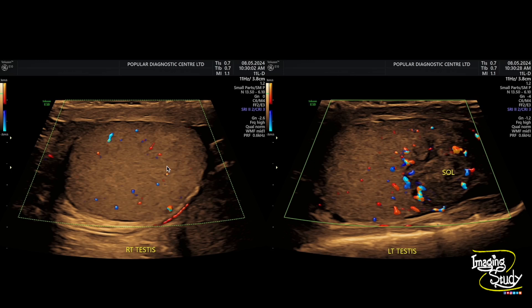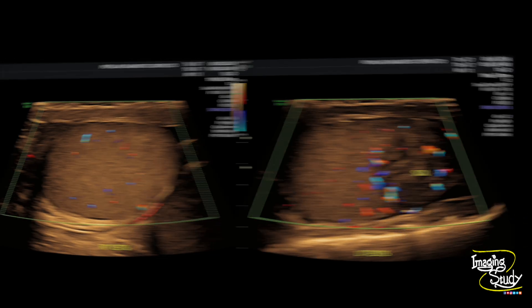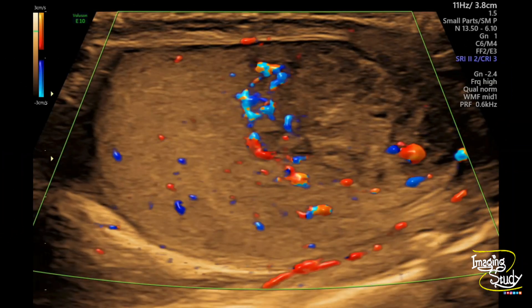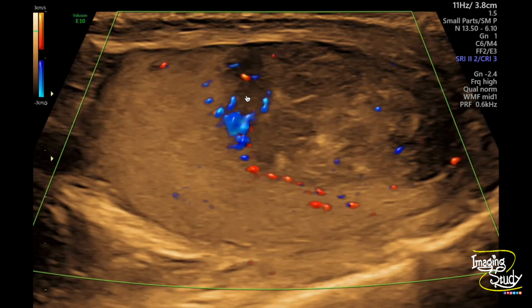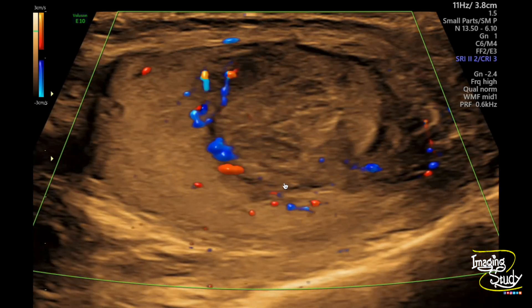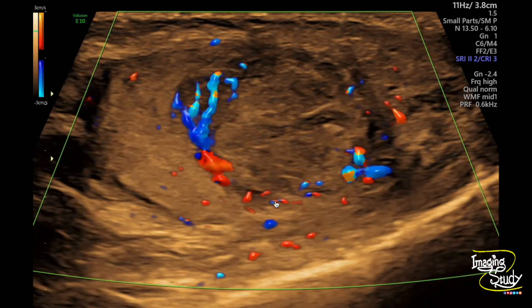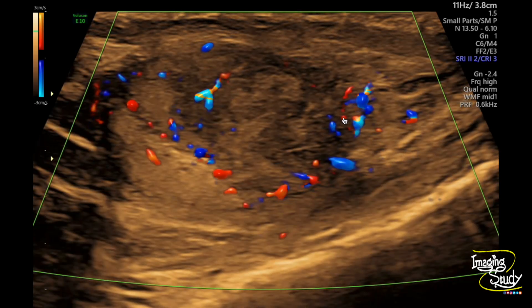On color Doppler you need to compare the abnormal testis with the normal one. We have adjusted the color Doppler settings for the normal testis, and with similar settings you can see on the left an increased peripheral vascularity. On real time you can see prominent, disorganized vascularity at the peripheral part, and you can also see some internal vessels supplying the mass.